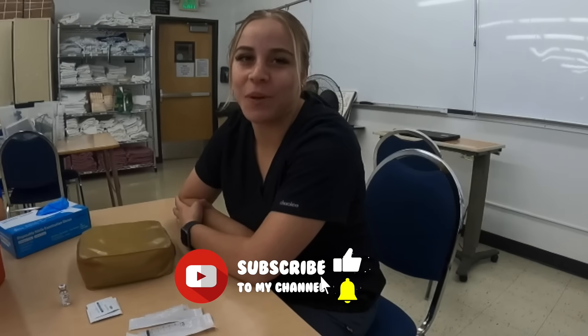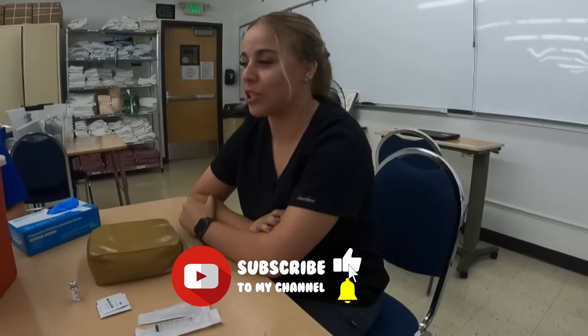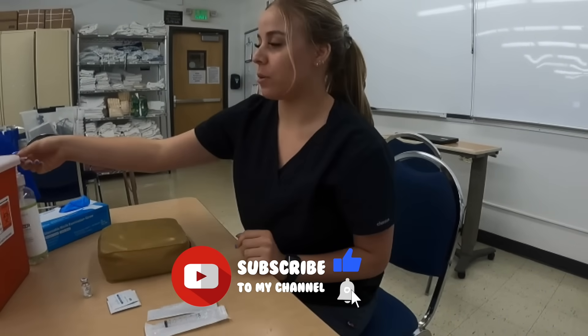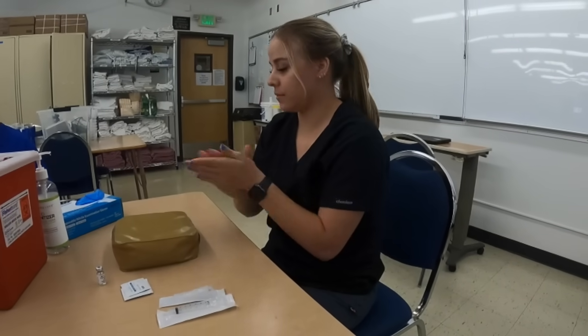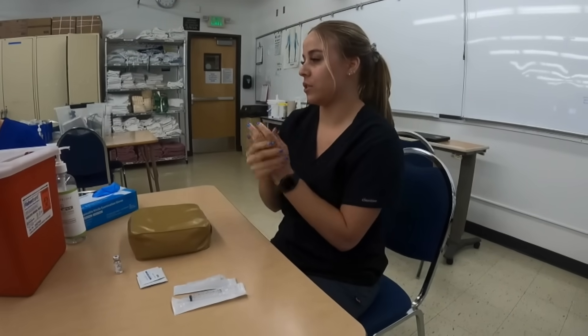Hi, I'm Sophia and today I'm going to be teaching you how to do an IM injection. First I perform hand hygiene and then I put on my gloves once the hand sanitizer is all dry.